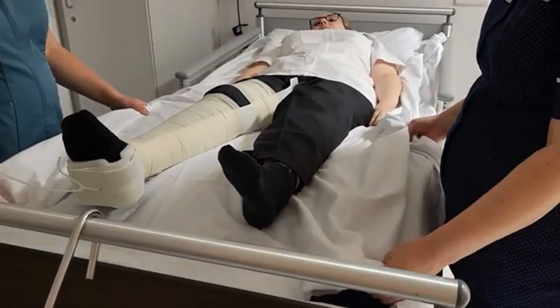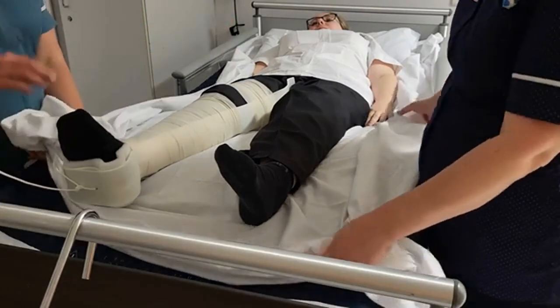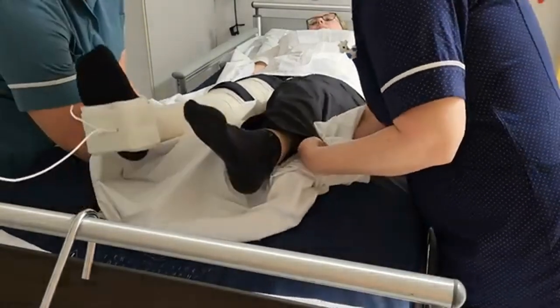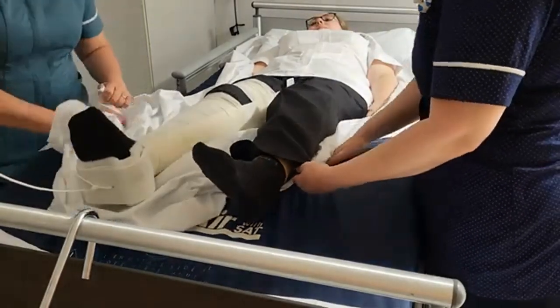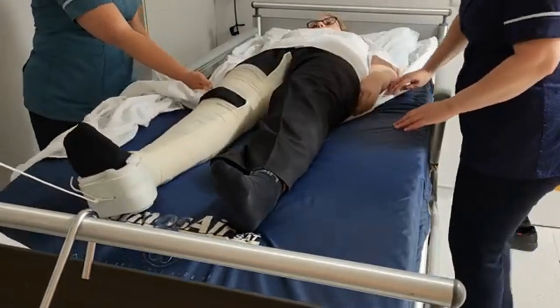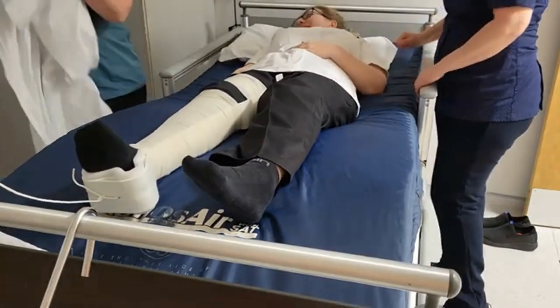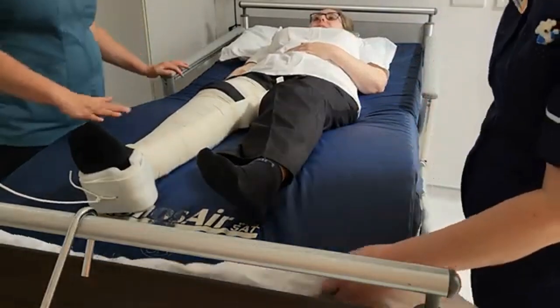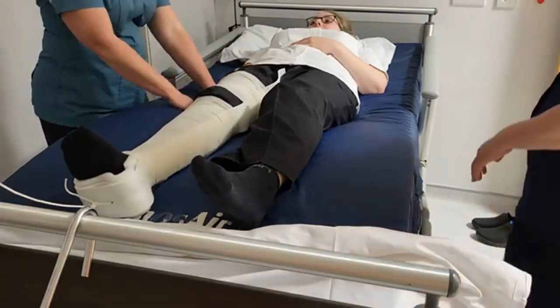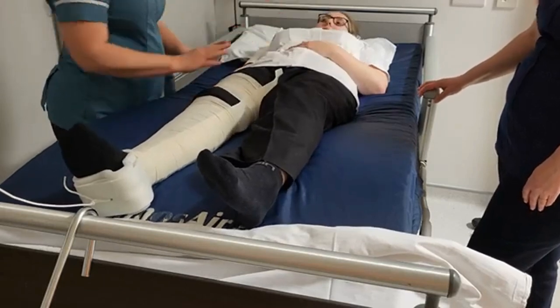To change the sheets for a patient in traction, which you may need to do particularly after toileting: remove the current sheet they're lying on. Get the far corner of the sheet and pass it underneath itself; the person on the opposite side can pass it to you. Using the underneath corner, start to pull the sheet from underneath itself. If the patient can, they lift their bottom up as you pull the sheet out and remove the dirty sheet. You can do cares on the patient at this point and clean the bed underneath.